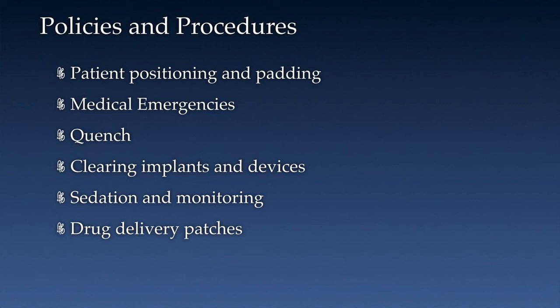What about clearing implants and devices? What are your policies and procedures on that? Does every technologist understand the procedure, and is it followed? Sedation, patient sedation, and monitoring of patients. Again, you need to have policies and procedures in place. Drug delivery patches, how are these assessed? Who determines how they are to be removed? What about making sure that they're put back?